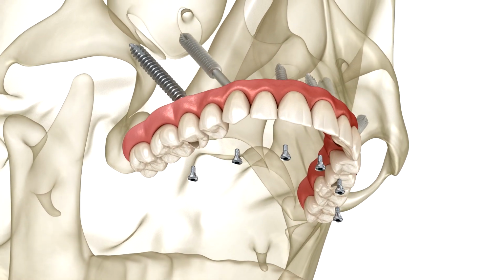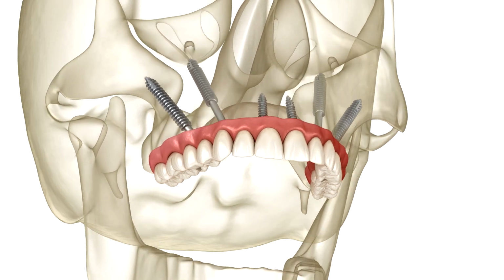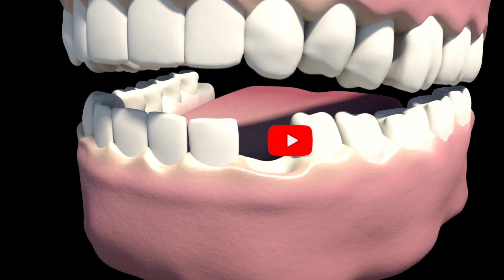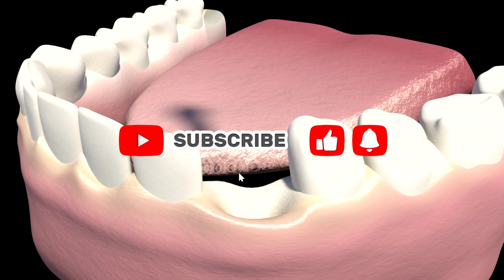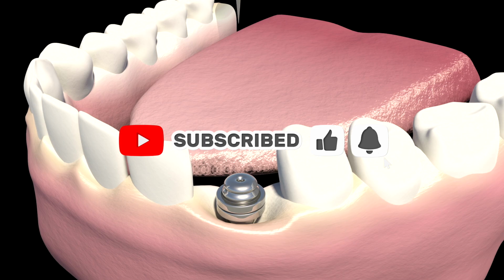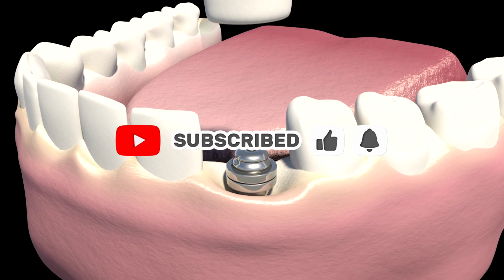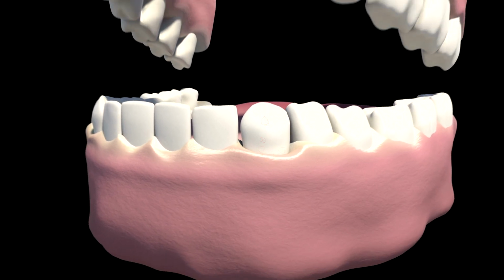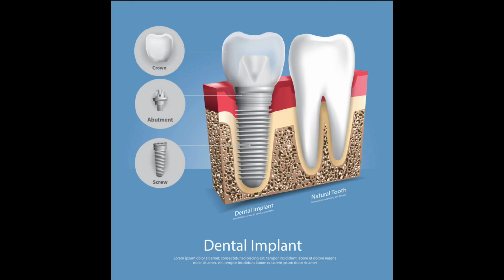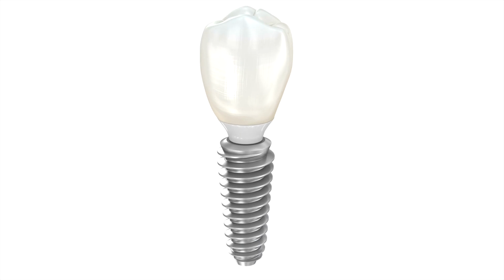An implant is a mechanical anchor in a biological environment. Understanding its components is critical for achieving optimal primary stability and long-term success. This lesson will help you look beyond the marketing and evaluate the device based on engineering and biology. 3D focus: we are moving from the biological constraints revealed by CBCT to the mechanical solutions offered by engineering. The choices made here directly mitigate the risks we identified in Lesson 1.